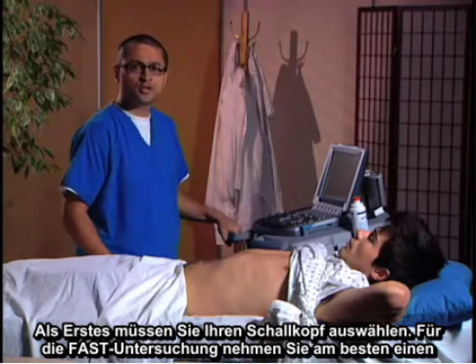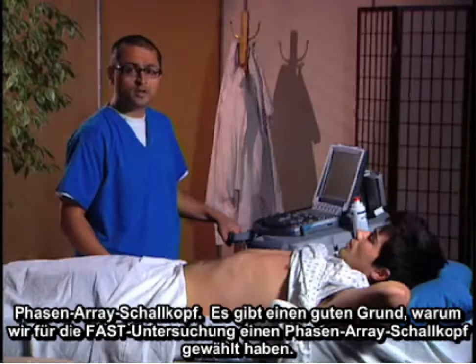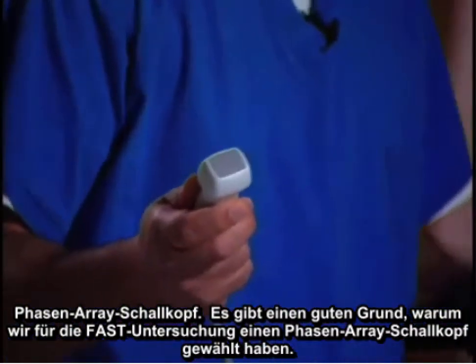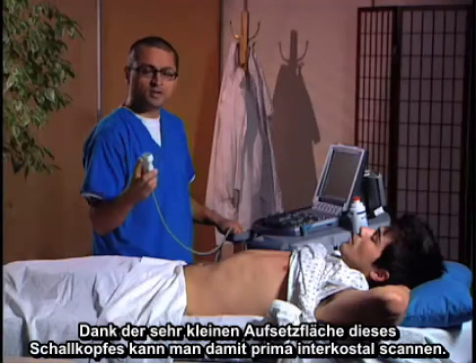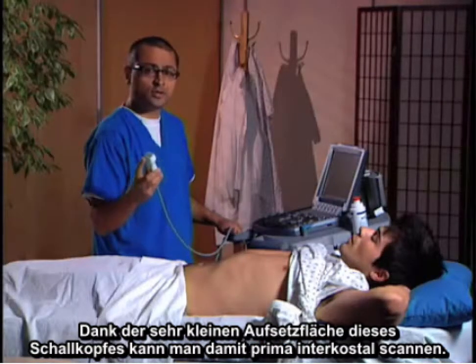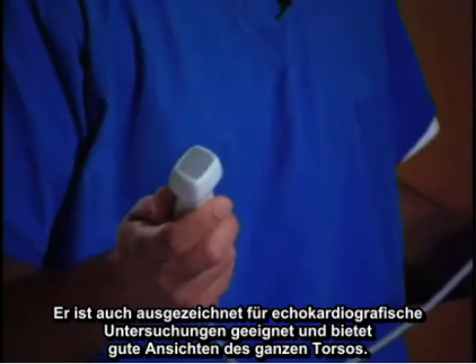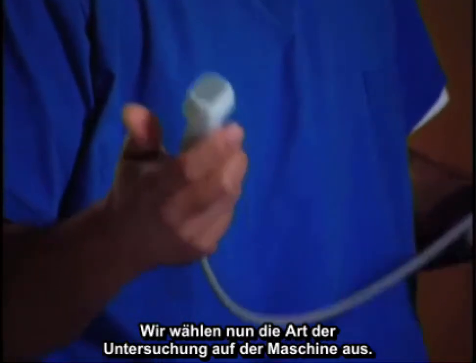The first thing you're going to do is choose your transducer. For the FAST exam, you're going to want to use a phased array transducer. We've chosen it for a particular reason: the small, tiny footprint of the transducer allows us to do great intercostal scanning. It also provides great echocardiographic examinations, allowing us to get good views of the full torso.